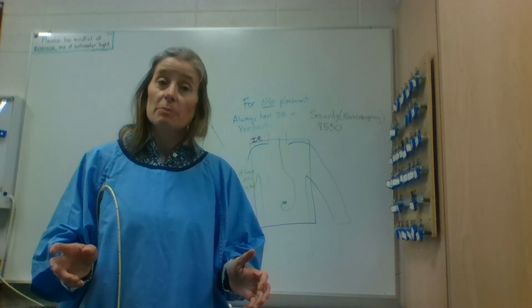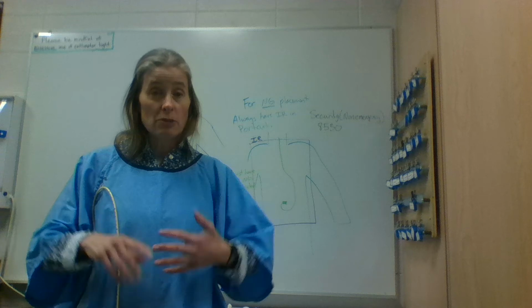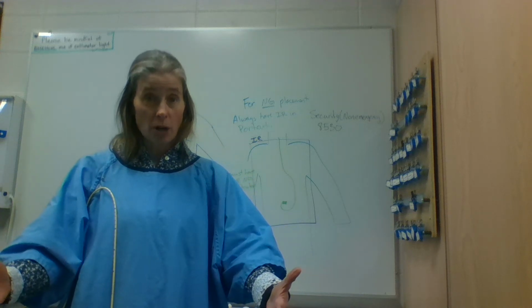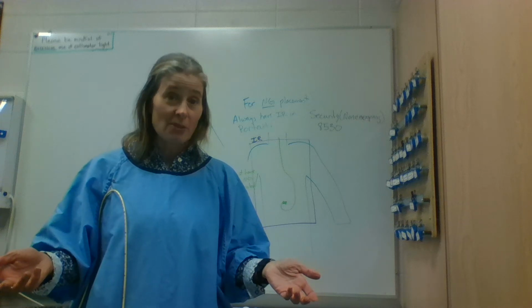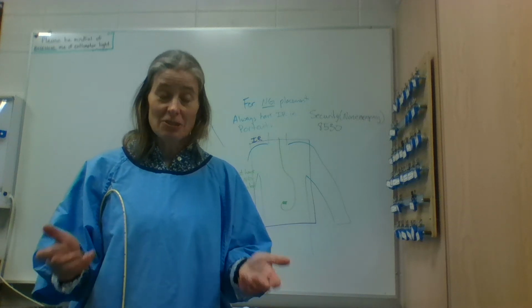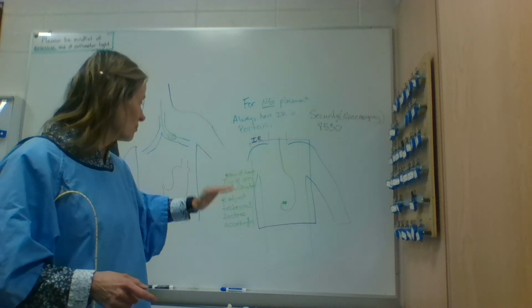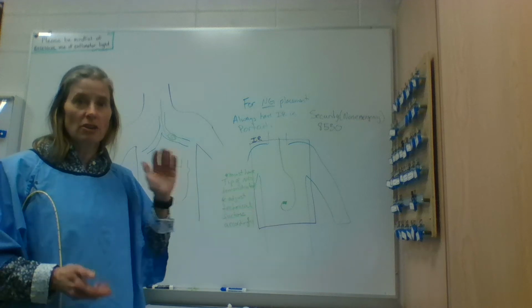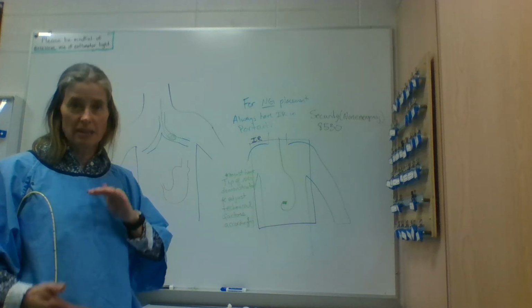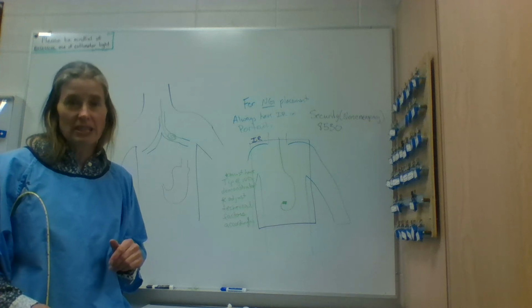So we're going to possibly have to increase our mAs, maybe even the kVp. If you have a full-figured individual, it's almost like a hybrid chest and abdomen. And we're not worried about the chest. The purpose of taking this AP chest x-ray is for NG tube placement. So please consider adjusting your image receptor superiorly and inferiorly, and also please consider the technical changes that you're going to have to make.